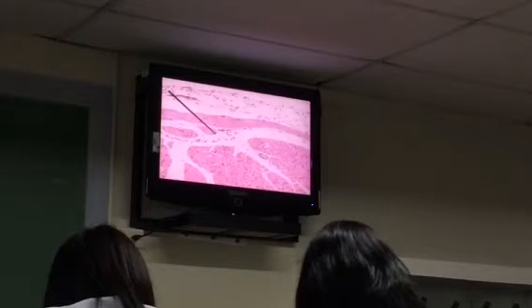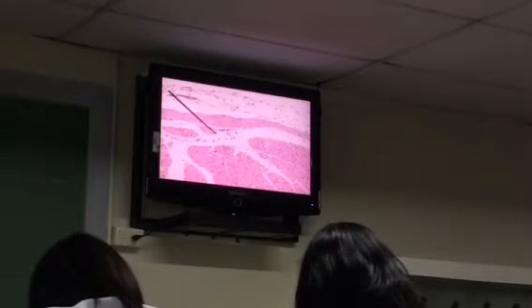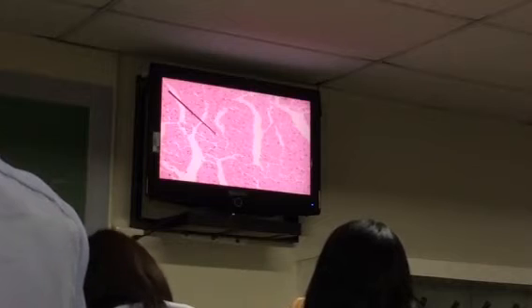Nakukuha, class? Okay. So, pagdating dito, myocardium ang layer. Aralin nyo ulit yung inyong cardiac muscle cells. So what is the characteristic cell sa myocardium natin? Cardiac muscle cells. Number of nucleus na nga ulit ng inyong cardiac muscle cell? Mono or bi.